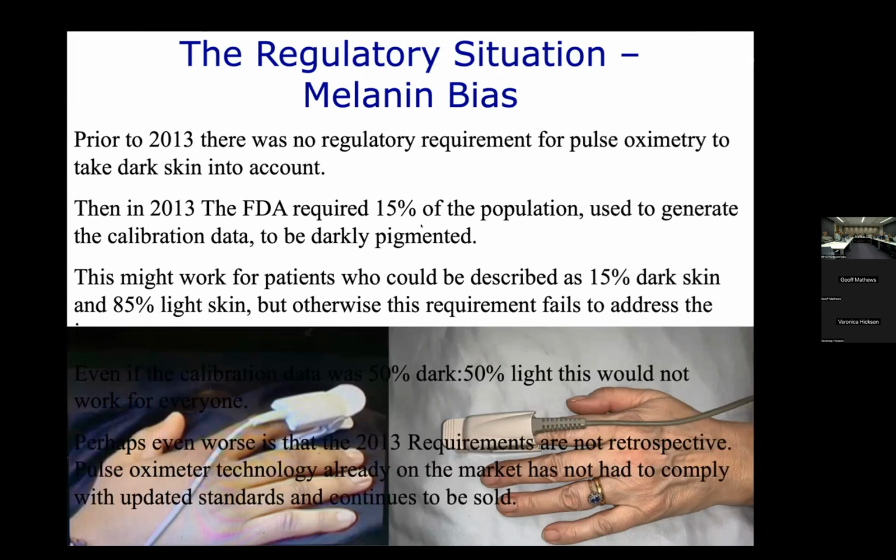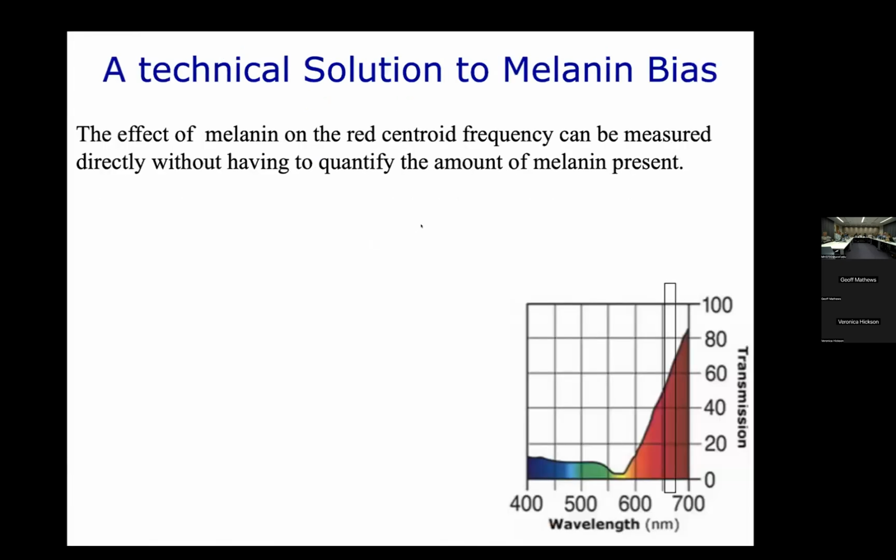I can't see it on that slide, but I'll read it out from another slide. Perhaps even worse is that the 2013 requirements are not retrospective, and pulse oximeter technology already on the market has not had to comply with updated standards and continues to be sold. Next.